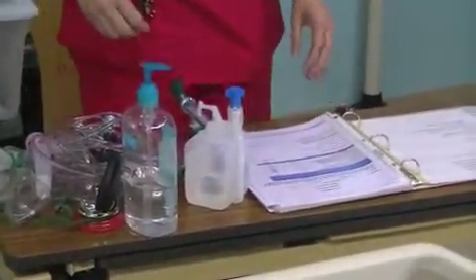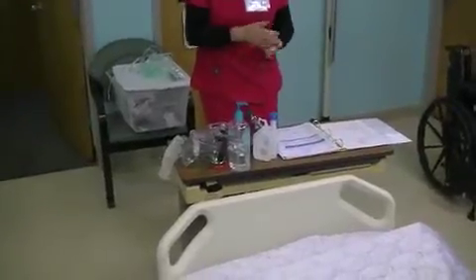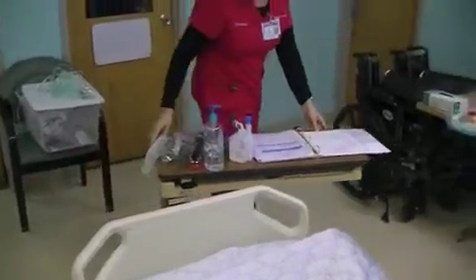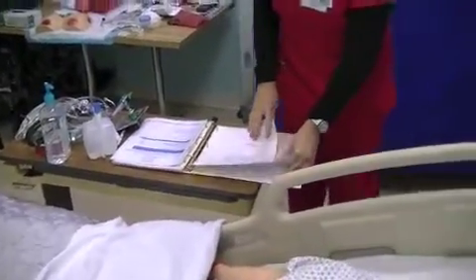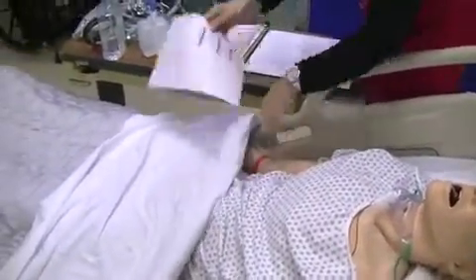I'm getting ready to go into the patient's room, so I'm going to knock on the door. Nurse saying, wash your hands, because remember, it's a federal regulation in a nursing home. You must identify yourself and where you're from when you come into the room. Hi, good afternoon. My name is Mrs. Kyle. I'm going to be your nurse today. Can you give me your name and date of birth, please? Okay, Mr. Pierce, and your date of birth, 10/3/1960.